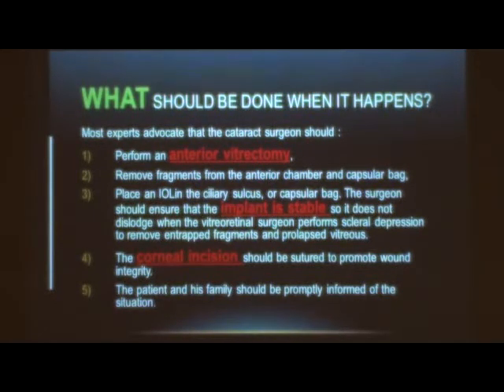The corneal incision should be sutured to promote wound healing and integrity, because once we go with a vitrectomy, we don't want a collapse of the anterior chamber. And the patient and his family should be promptly informed of the situation if you are going to postpone the case to a second day or a third day. Be frank, be honest. This is the most important thing that protects you against medical legal issues.